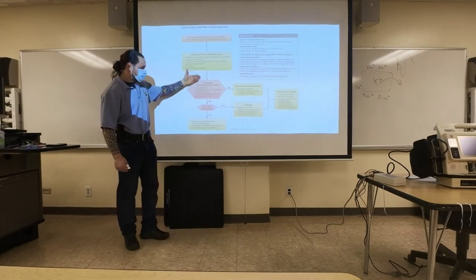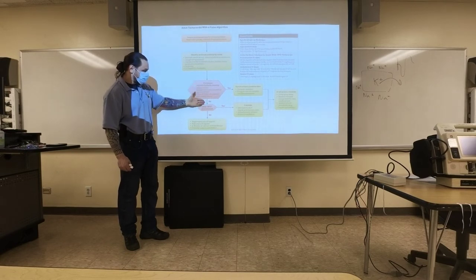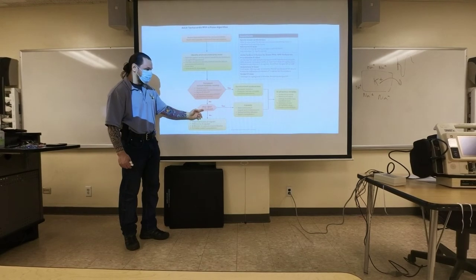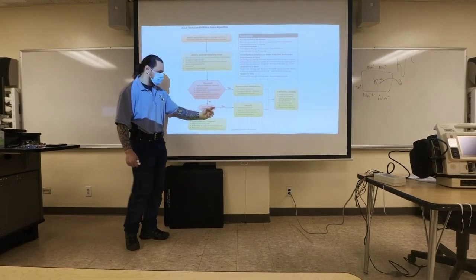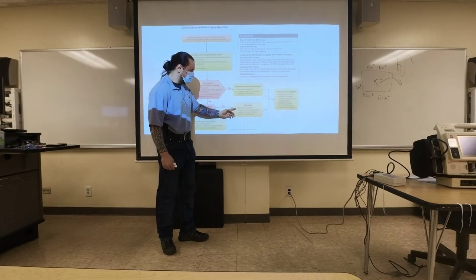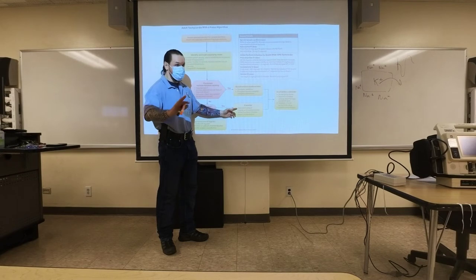Now, let's say they do not have these conditions. Is your QRS wide or narrow? Wide means they're probably ventricular in origin. So we say yes. Here, they have some medication that is not in your protocols. They give adenosine because they want to see what the underlying rhythm is. Do not give this medicine. It's not in your protocols.